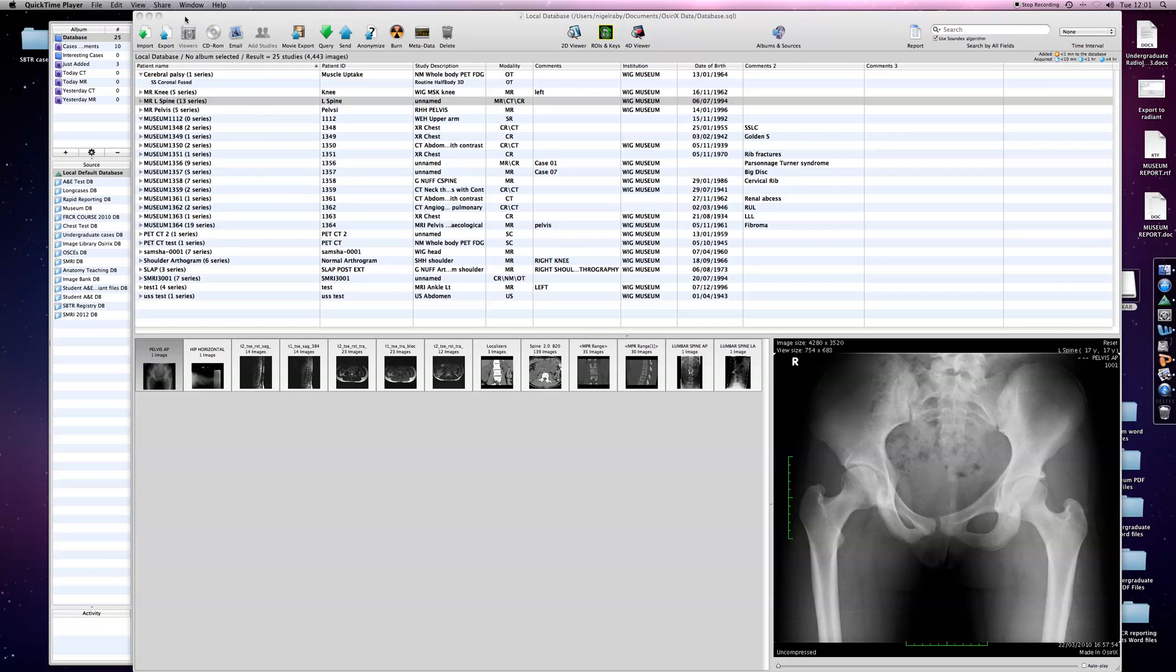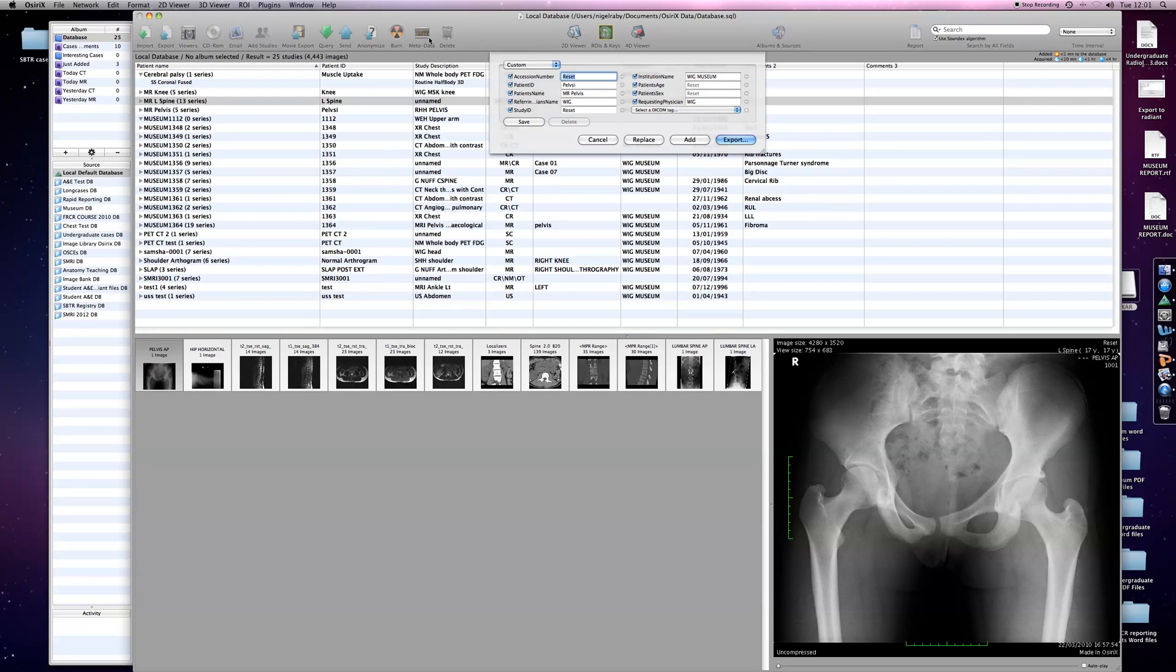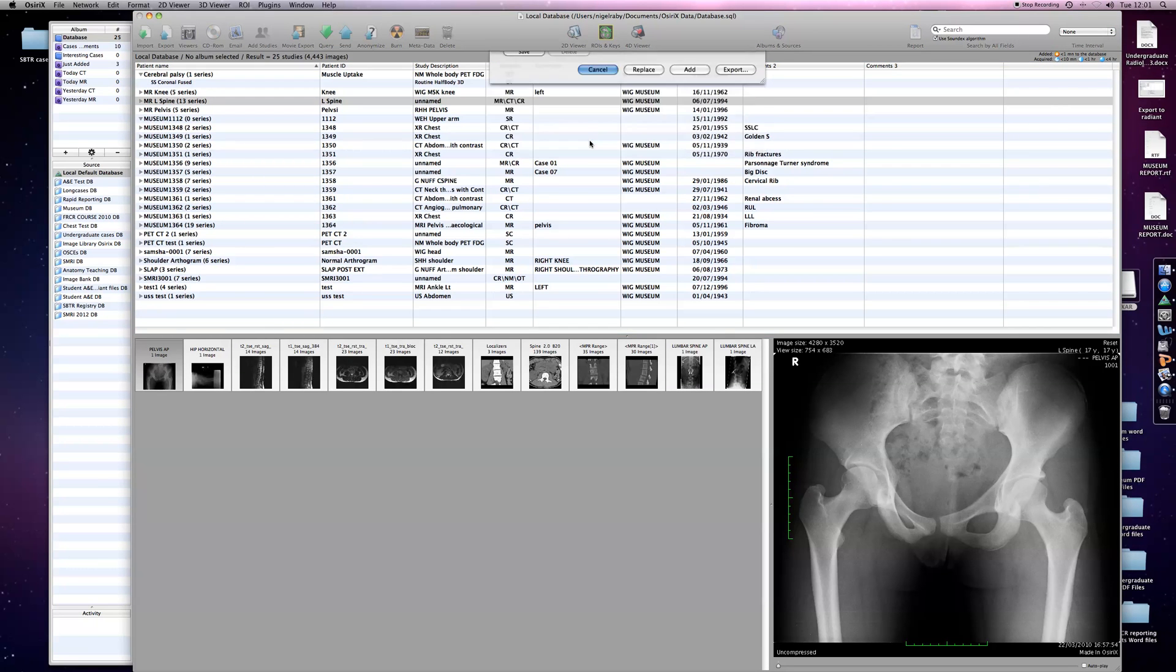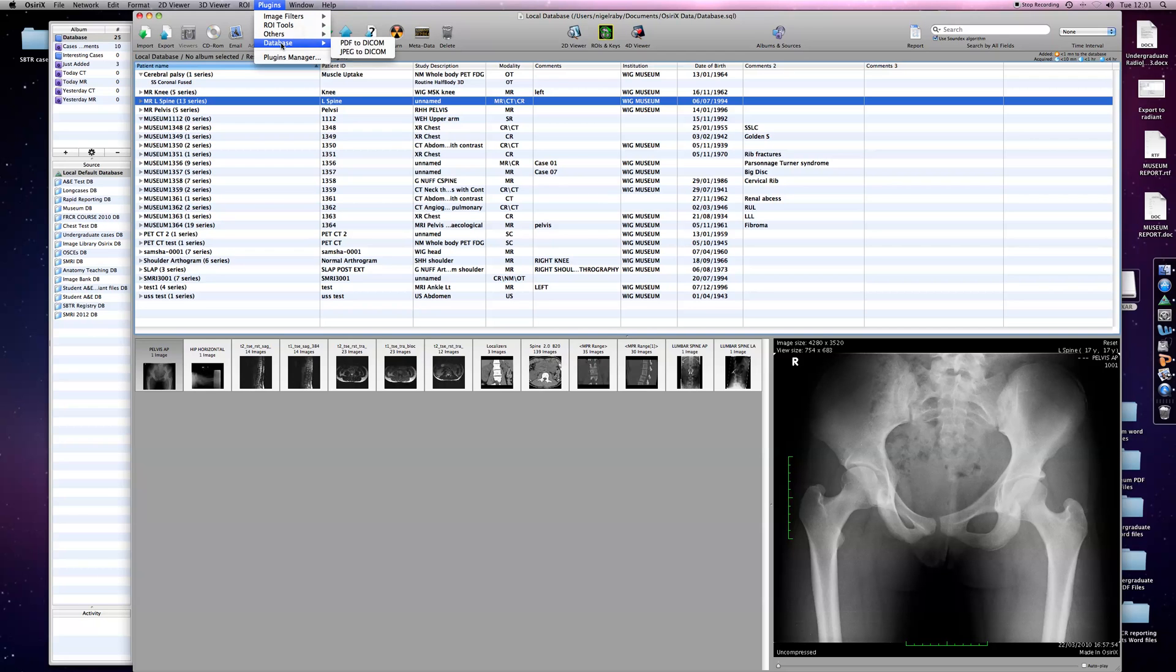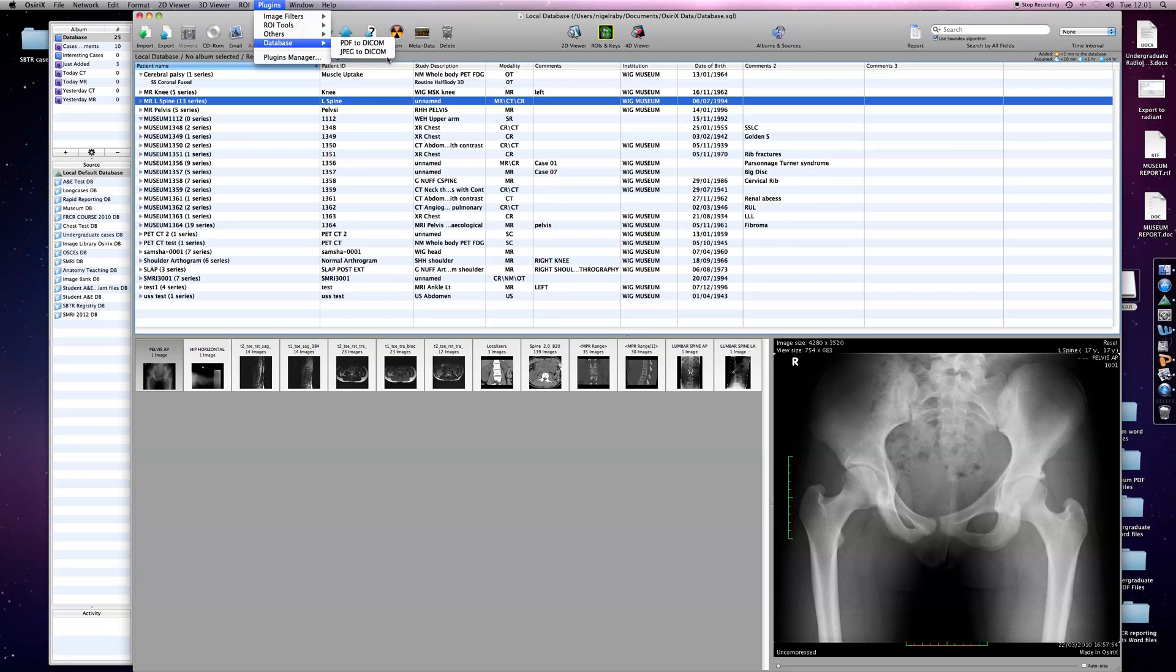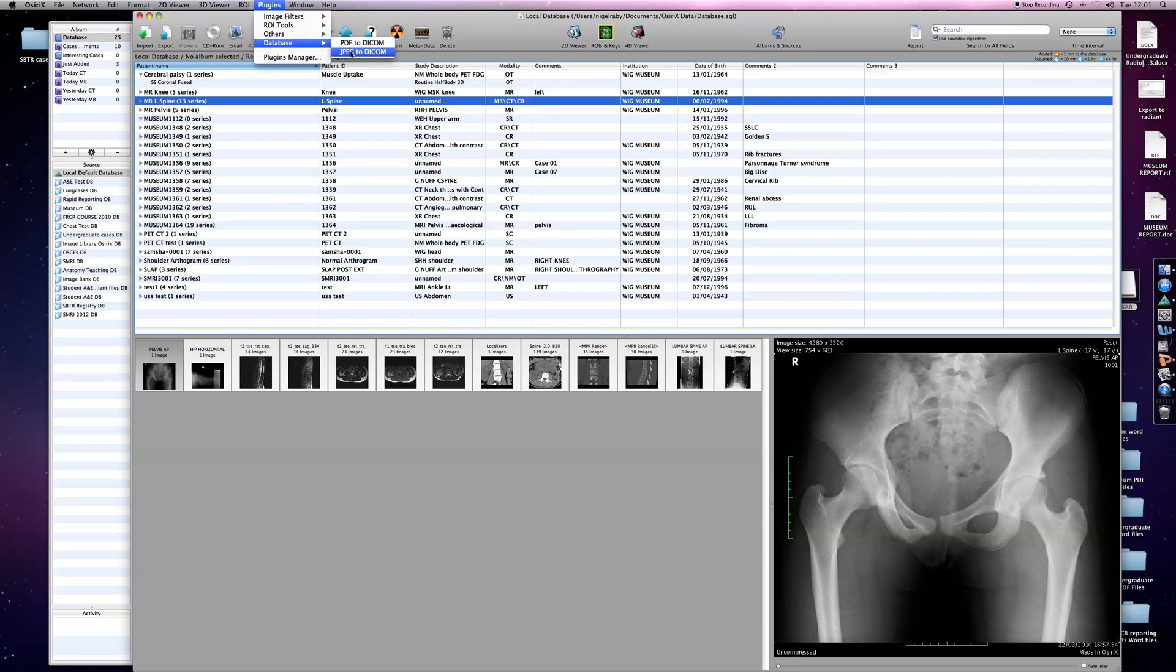The key area we need is plugins. If you highlight plugins at the top and scroll to database, you'll see this gives you an option to convert PDF files to DICOM and JPEGs to DICOM. As OSIRIX works with DICOM only, we need to use this facility. Any text or other information we're going to add has to be in PDF or JPEG format initially.